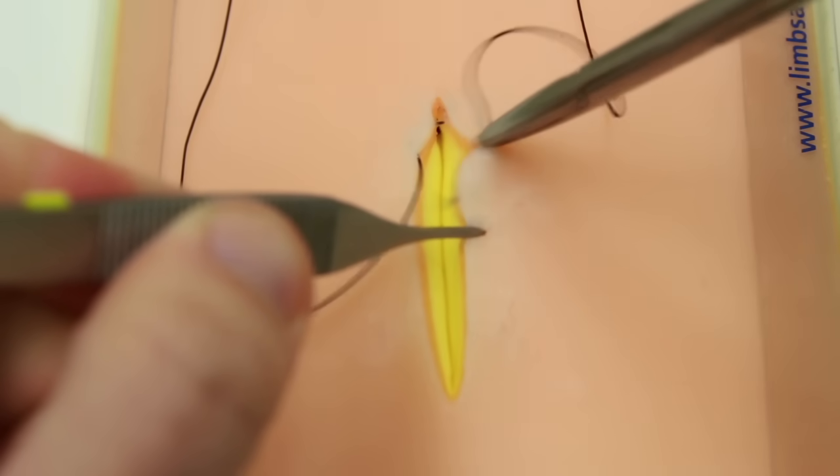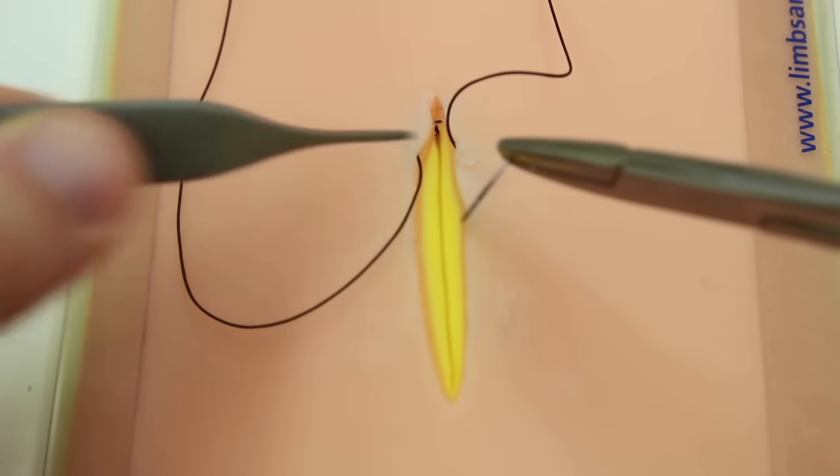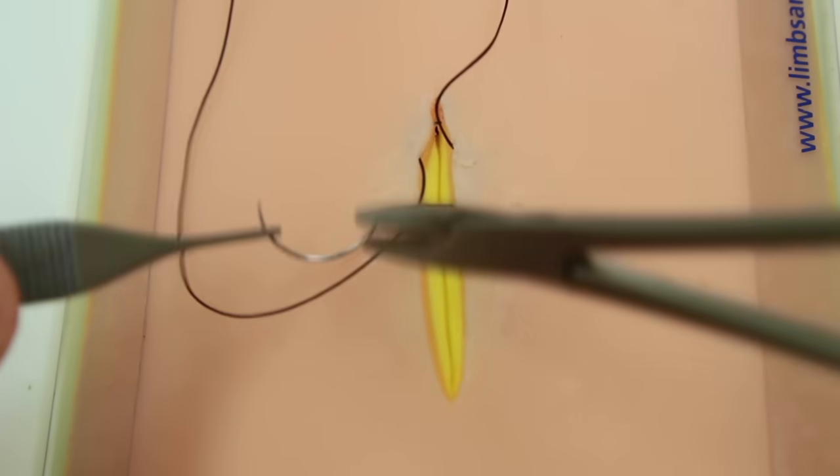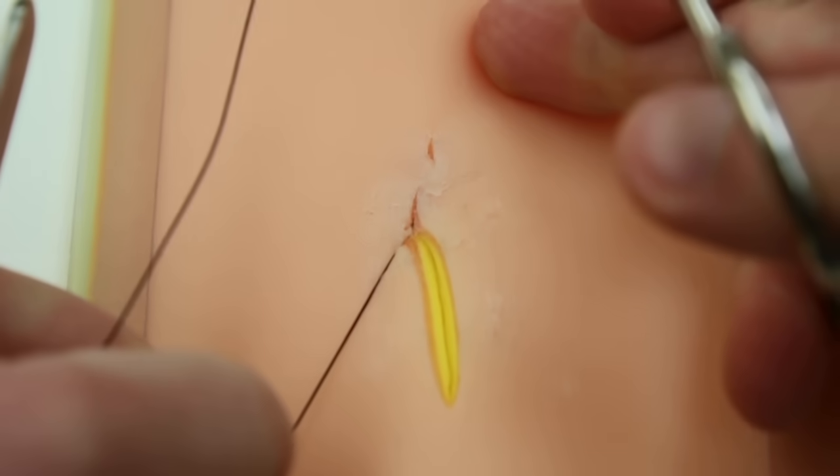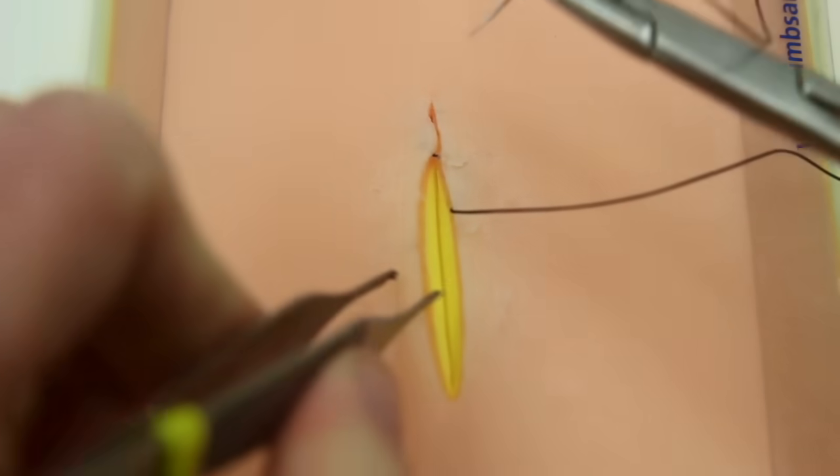Going in that dermal-epidermal junction. Making sure when you look across that you're coming in and out at the same level. That can really make a difference because when you aren't, there can be sort of a step or a ledge.